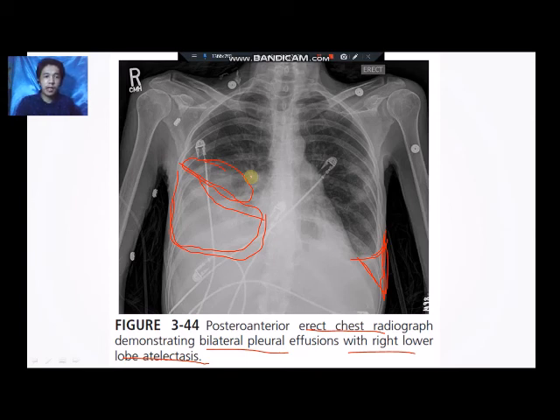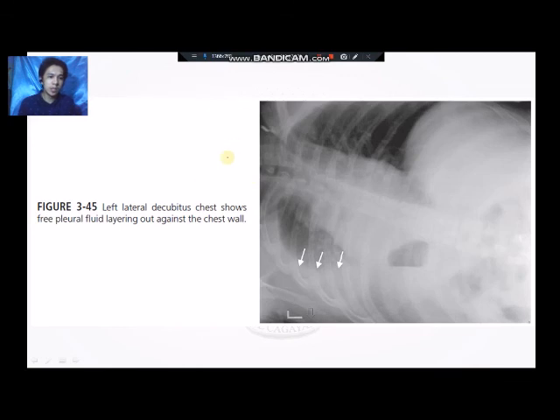Okay, so if ever na pleural effusion ang inyong patient, puhon-puhon nga ma-x-rayhan, as much as possible ipatindog yun inyong patient. Kung dili kaya mo tindog ni patient, ipalingkod si patient. Kung dili kaya mo lingkod ni patient, then do this procedure. Butang lang nato the affected side of the patient is on the right side. So dapat kung muhigda si patient, naapod sad siya sa iyahang right side.